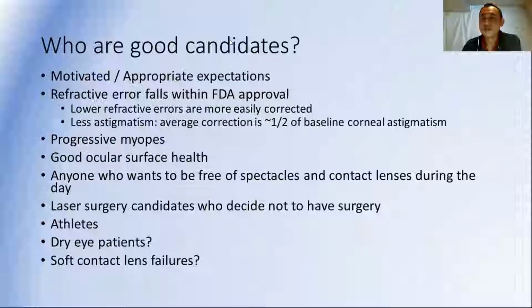More questions. Is once-a-year replacement compulsory? No, it is not. It's really your judgment call. I recommend it because for most patients, that's about the time when the lenses look like they need to be replaced, and I want to make sure that they don't have problems over time.